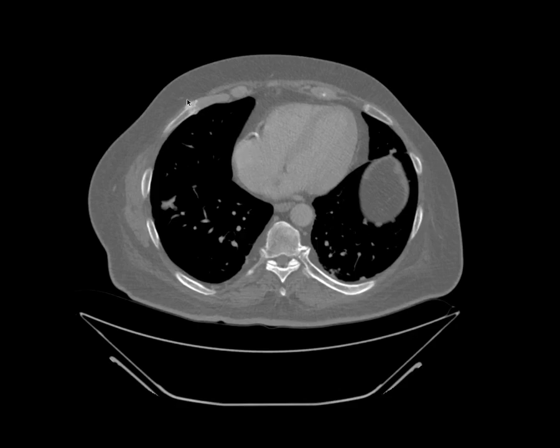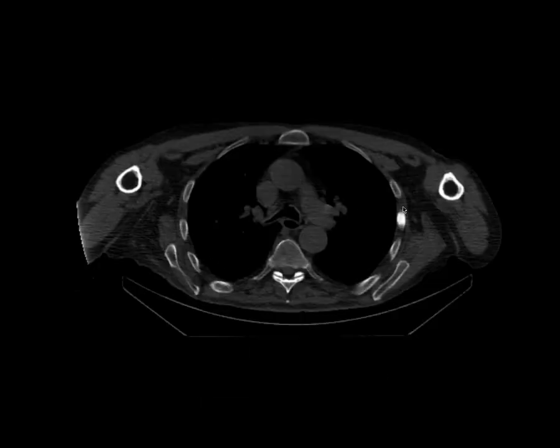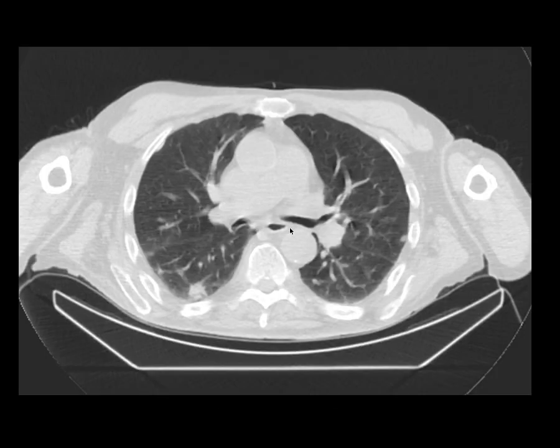For comparison, here is the patient with the rib focus showing a fracture and callus formation around it — a very different CT appearance. This first patient also demonstrated a mass lesion in keeping with a primary bronchogenic carcinoma, or possibly a metastasis. This alerts us to the fact that we have to look all over the SPECT CT — the mediastinum, the lungs, everywhere — for coincidental findings. In conditions like prostate cancer with a good long-term prognosis, a carcinoma of the lung might kill the patient within a couple of years, so it's extremely important to pick those up.